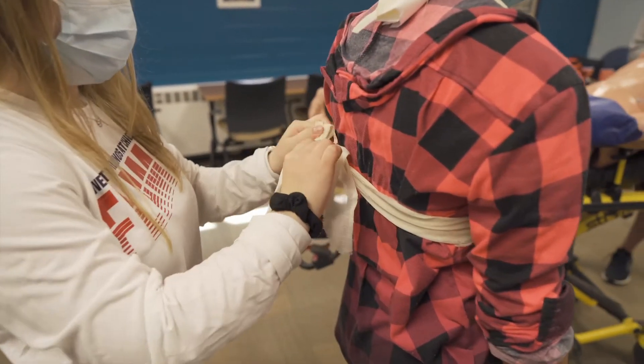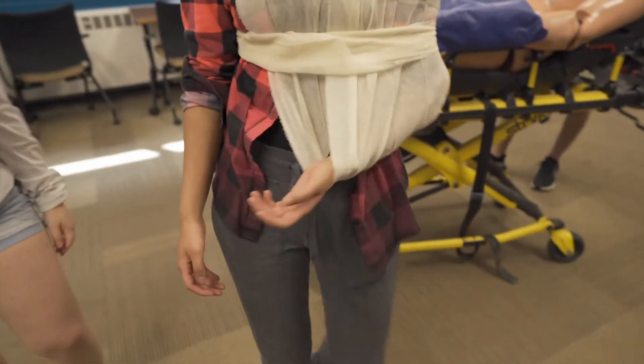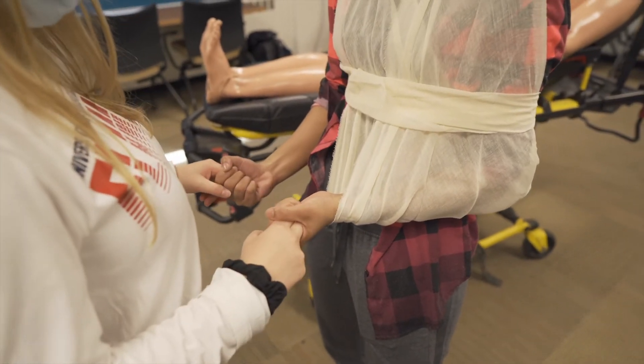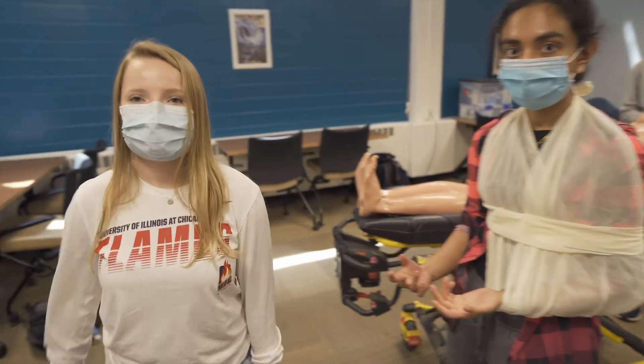After applying the swath, we reassess PMS. Checking for pulse — pulses are good. Can you squeeze this? And can you feel these? All right, thank you Kimberly and Diane.